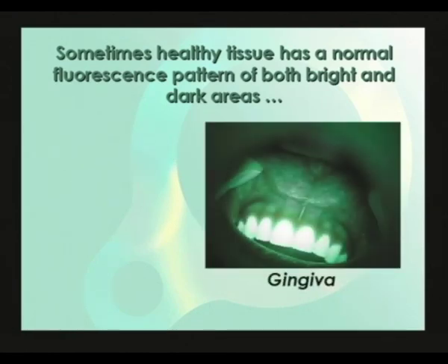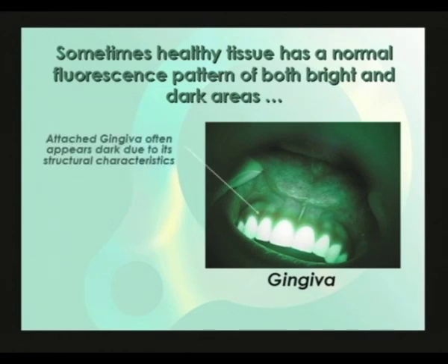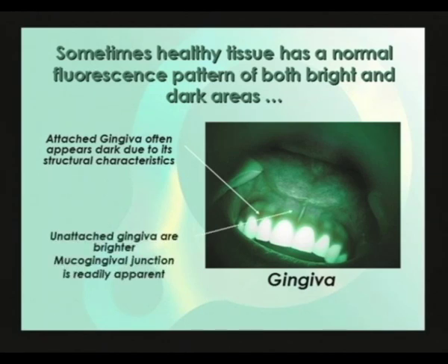Some oral mucosa appear homogeneously dark under Velscope due to their structural characteristics. A good example is the attached gingiva, which, while having a typically light pink appearance in white light, appears dark under Velscope. The unattached gingiva immediately adjacent to the attached gingiva have a brighter appearance more typical of other mucosal tissues, making the mucogingival junction readily apparent under Velscope. The theme of symmetry and bilateral presentation is again evident here — this principle is one of the keys to helping us decide what belongs and what doesn't.